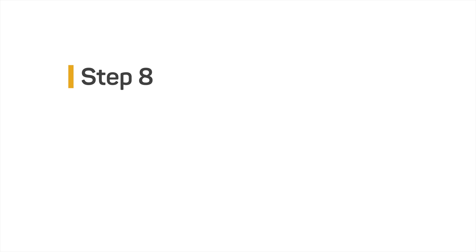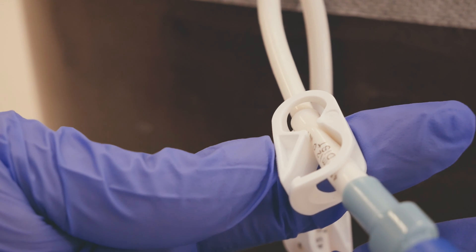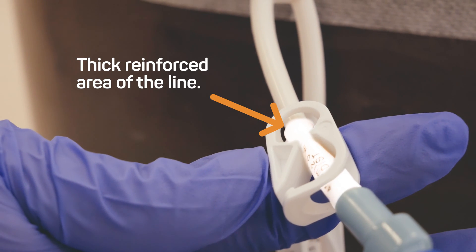Step eight: clamp the central line keeping your thumb on the plunger end of the syringe. Always place the central line clamp on the thick reinforced area of the line.